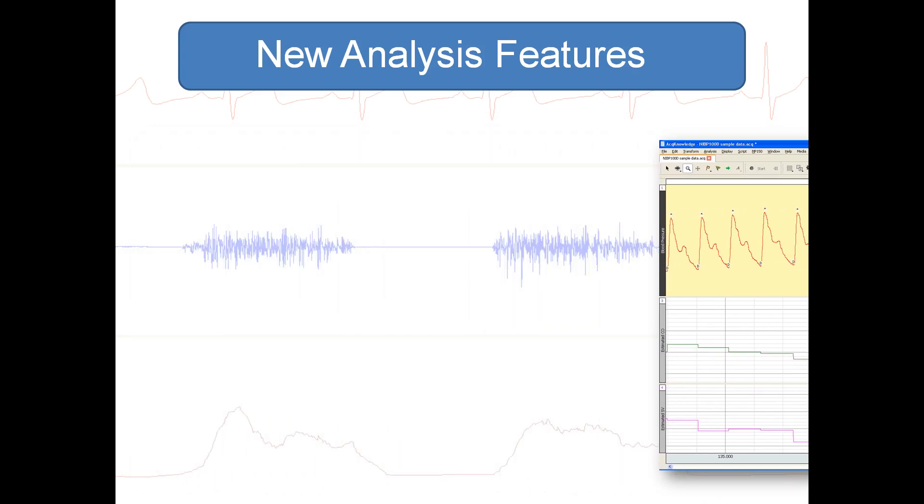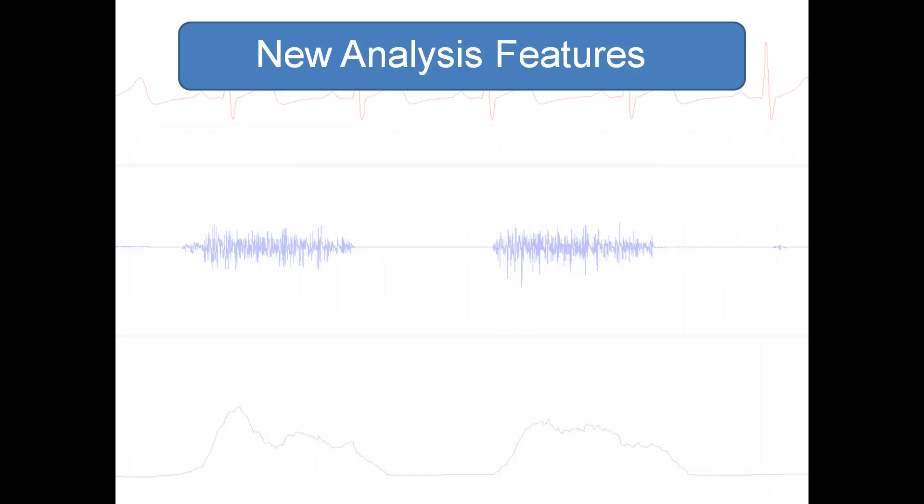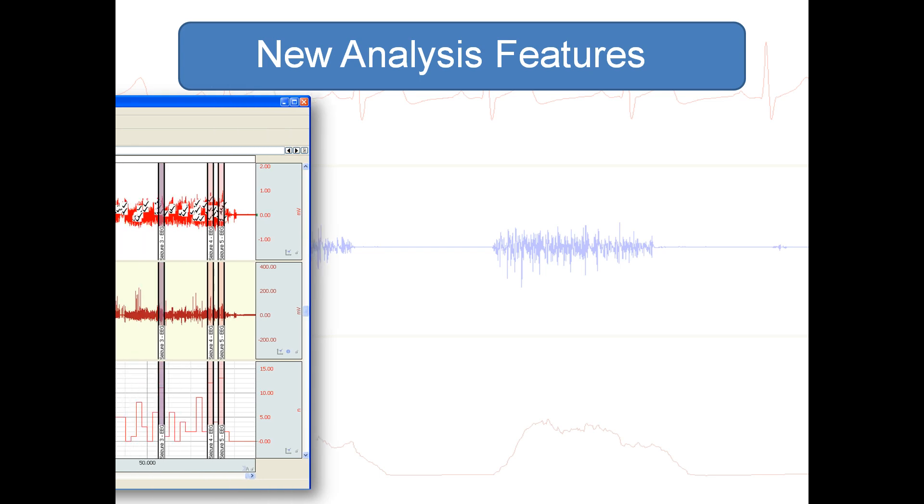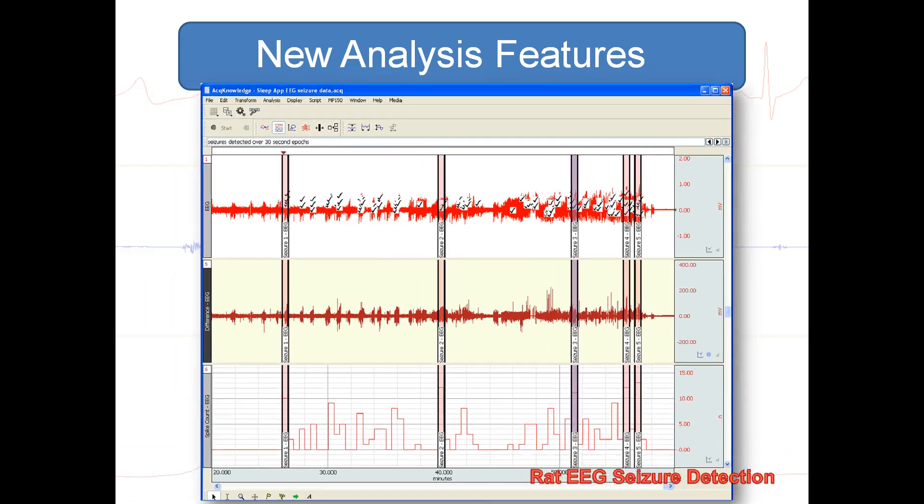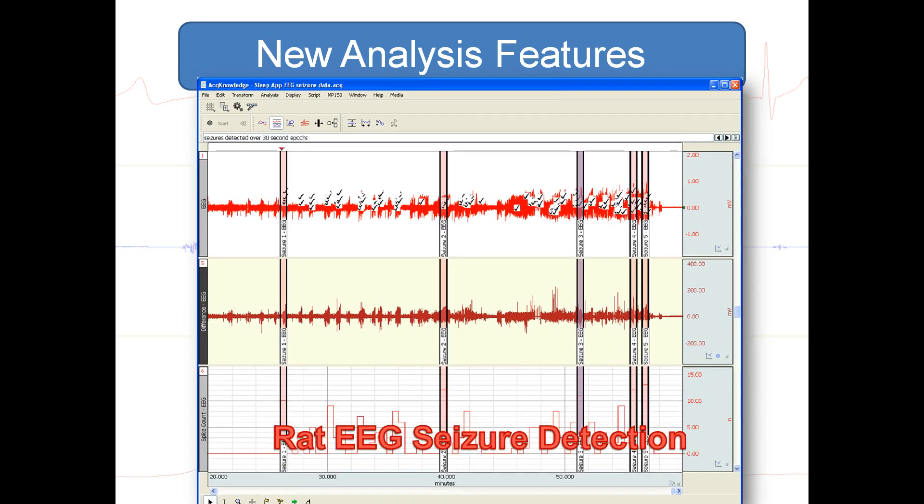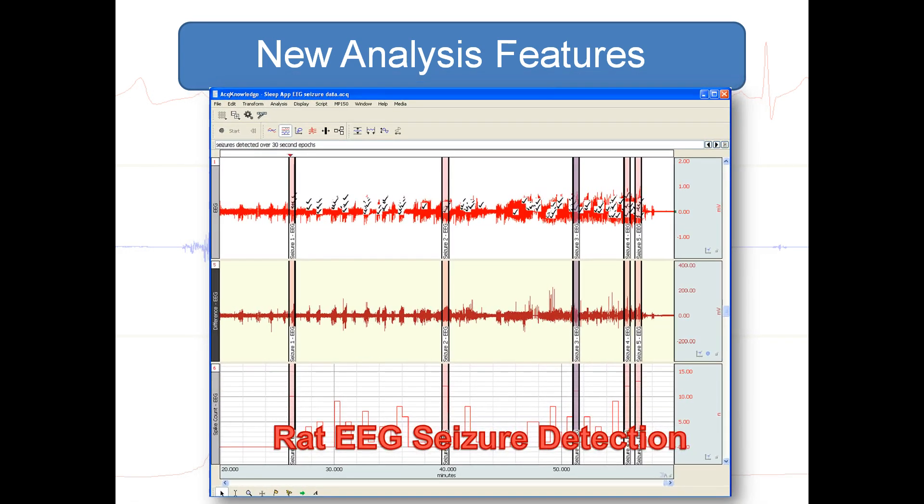Finally, AcqKnowledge includes a new rat EEG seizure detection routine with user configurable seizure parameters.